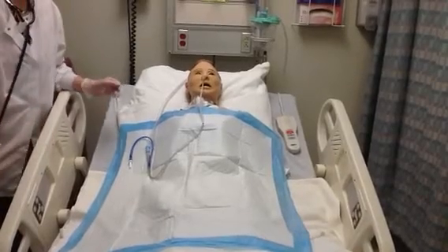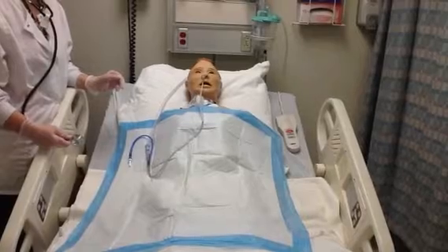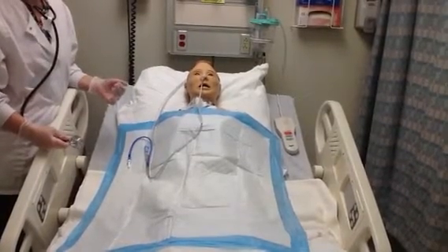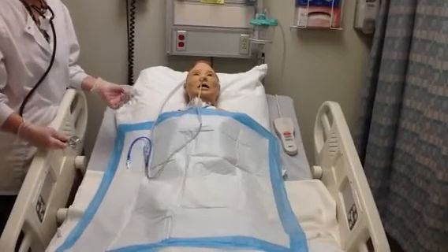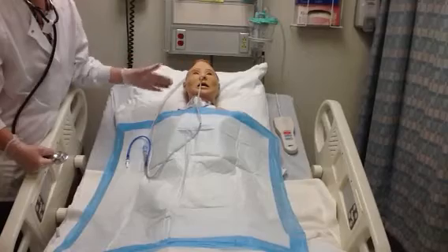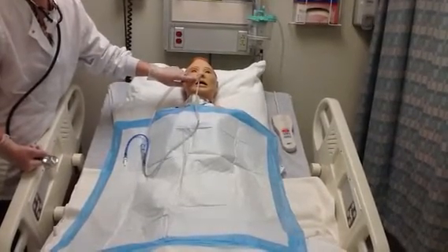Okay, I'm going to show you how to assess a patient who has an NG tube in place. So first we've identified our patient and we've done our hand hygiene, and now I'm going to assess the NG component. I'm starting off by taking an observation of the patient, and I'm looking at the insertion site of the NG tube.